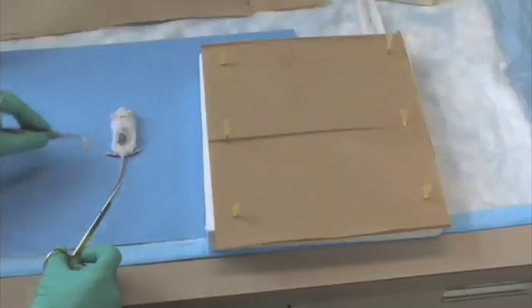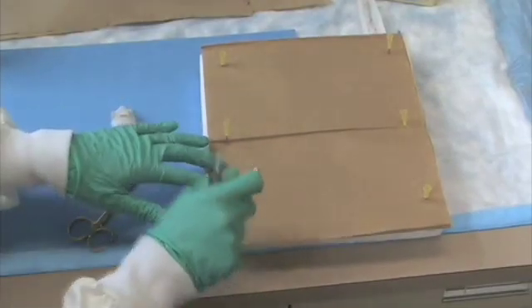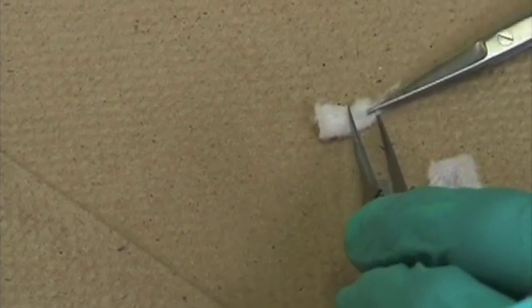When we're fixing the skin, we don't want the skin to roll up and be in a tube. We want it to be nice and flat. So, what we do in order to help that is we lay the skin on a paper towel so that it stays flat while it's being fixed.